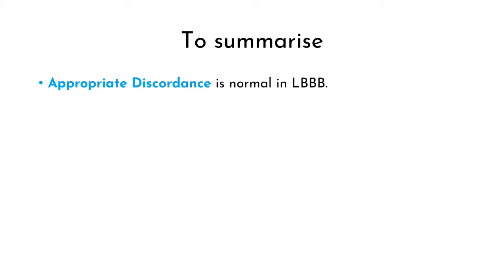Does this ECG fulfill Sgarbossa Criteria? Concordant ST elevation is present in lead 2, V5 and V6. Even though V5 has concordant ST elevation, it is not significant because the ST elevation is less than 1 mm. So criteria one is fulfilled only in lead 2 and V6. Concordant ST depression is present in V1, V2 and V3, so criteria two is also fulfilled. Excessively discordant ST elevation is present in lead 3 and AVF, clearly much more than 25% of the preceding S wave amplitude. In short, this ECG satisfies all three criteria and therefore is Sgarbossa positive.